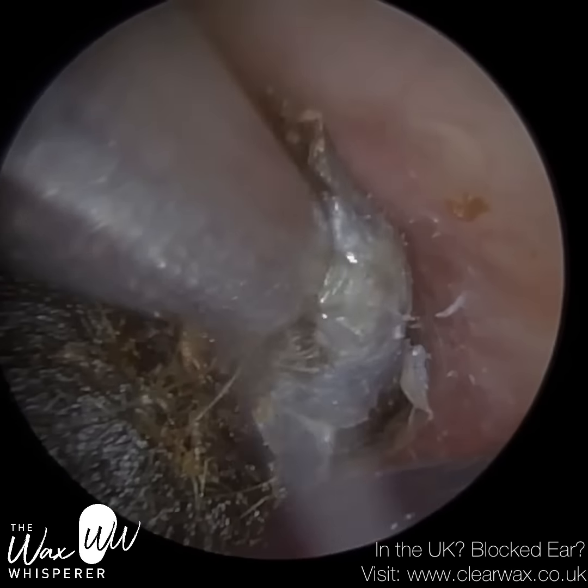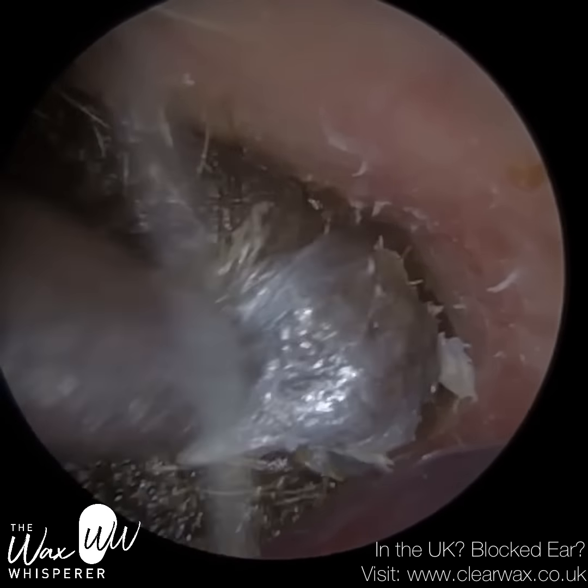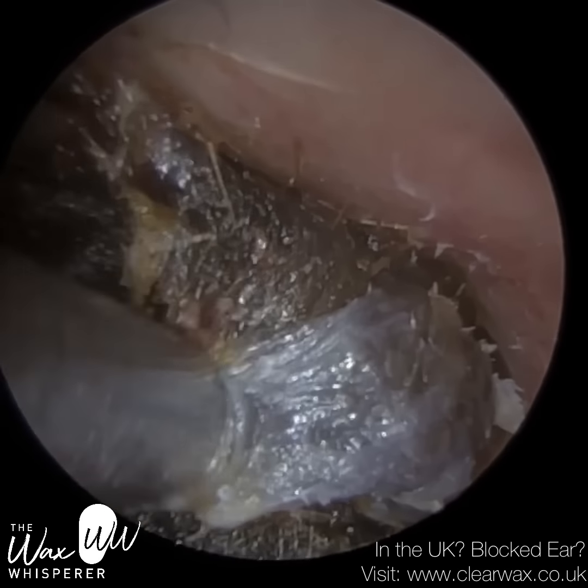We want to loosen this wax off the canal wall. You can see there's a layer of skin that's enveloped this plug of wax, which is also attached to the canal wall.